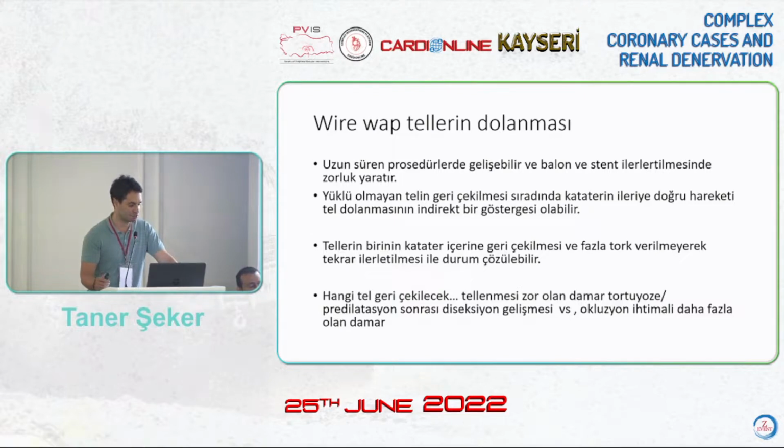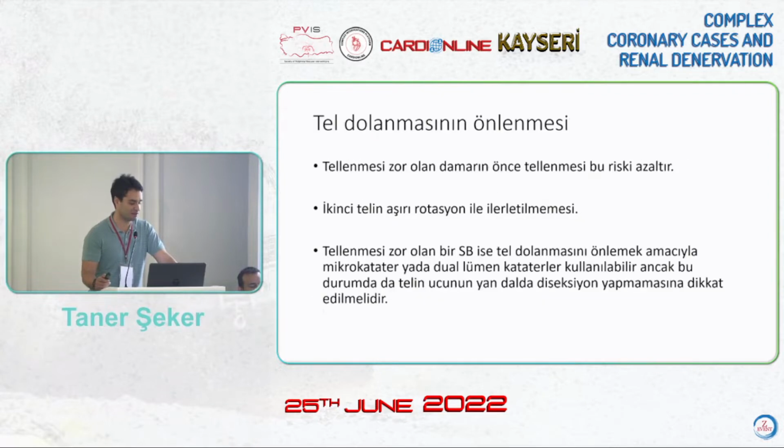We can pull back the wire, and without much torque, we can reposition it. Which wire to pull back, especially for the tortuosus or dissection developing after predilatation, or if there is occlusion possibility, we can keep that wire and reposition the wire. Without much torque, we can move it.